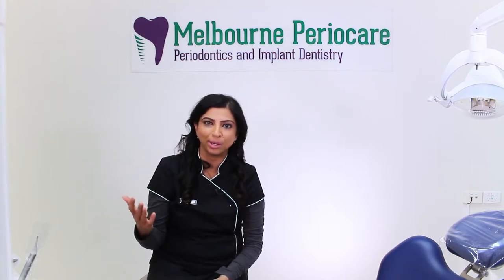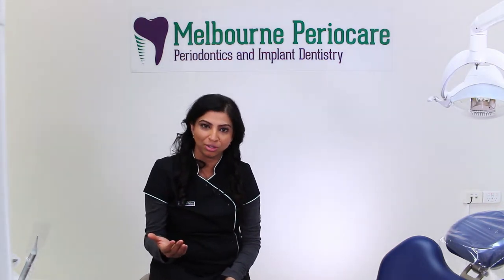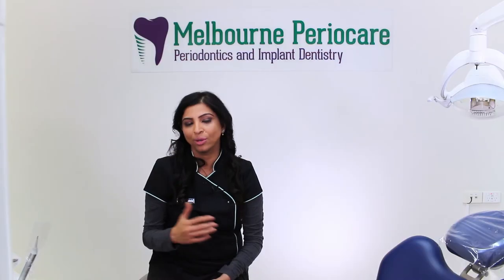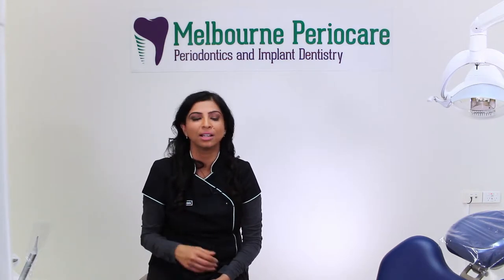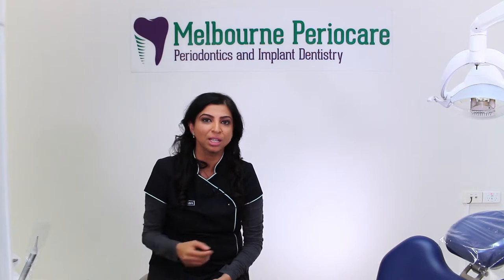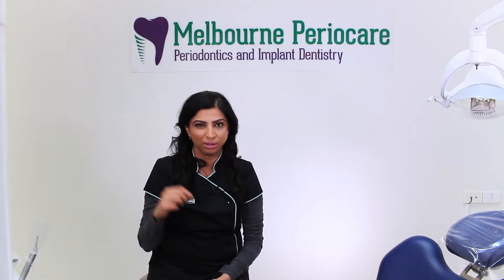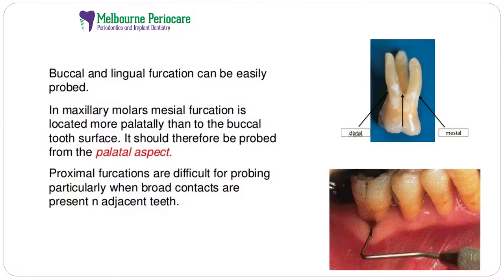Now, before I go ahead, I'm going to talk about some traditional diagnostic measures, and that includes probing and radiographs, and then some current ones such as cone beam CT scans. Let's start with probing. We all know that in order to actually look into the furcation zone and detect furcation involvement, we need to use a curved instrument. A Nabers probe or a graded explorer might actually be a very, very good tool to help detect the problem.